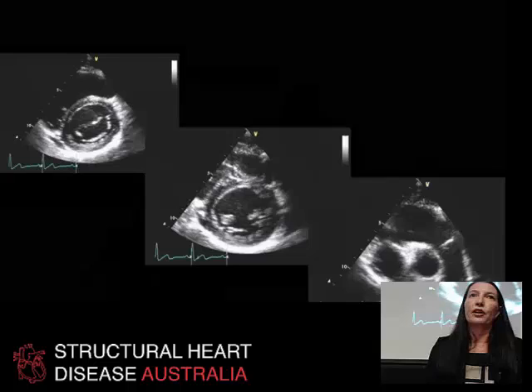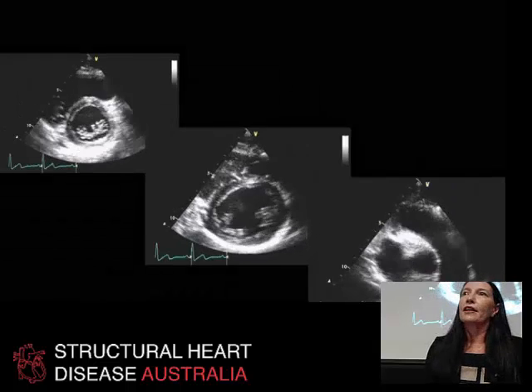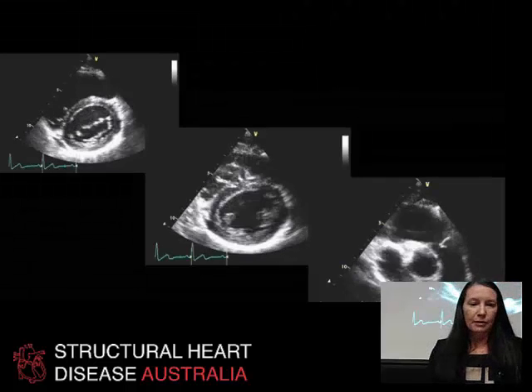In the short axis view, we can see all portions of the right ventricle. So while we might be looking at the left ventricle predominantly, we can certainly see the right ventricle and make some assessment of it.